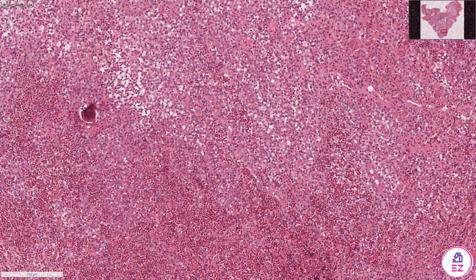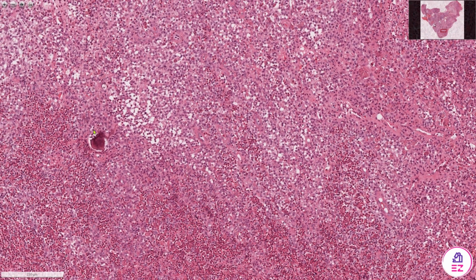The main thing to appreciate is that a biopsy of the mandible should contain lots of bone, and instead that bone has been destroyed by sheets of Langerhans cells. Over here I can see a tiny spicule of bone which represents residual mandibular bone, but as I said, much of it has been destroyed.